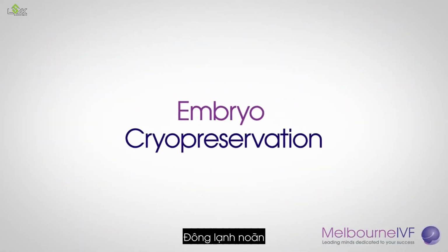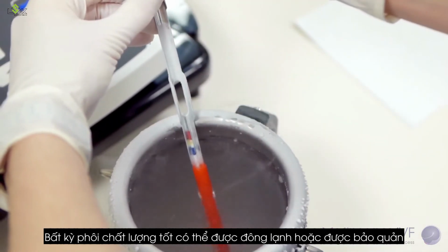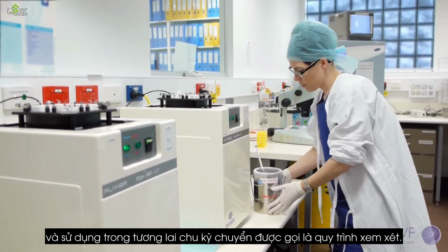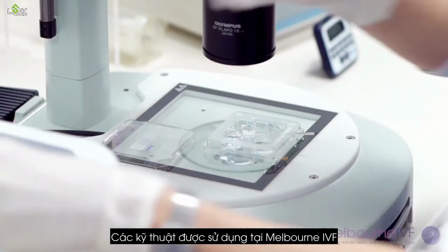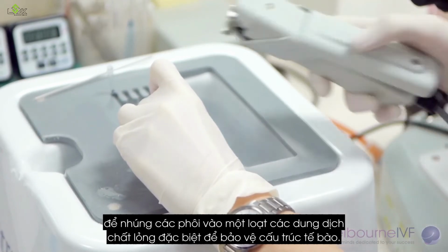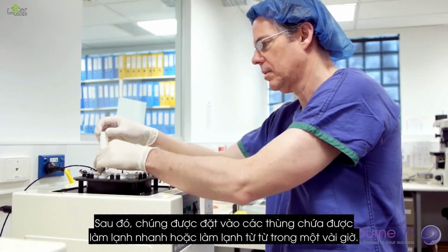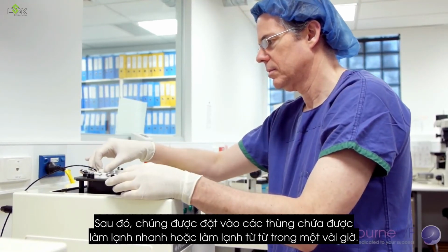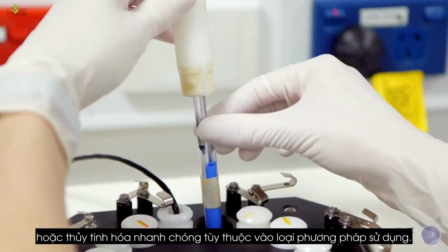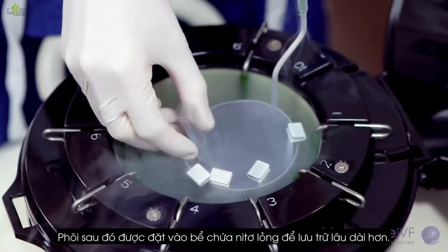Embryo cryopreservation. Any additional good quality embryos can be frozen or cryopreserved and used in future transfer cycles, known as a thaw cycle. The techniques used at Melbourne IVF are to immerse the embryos in a series of special fluid solutions to protect their cellular structure. They are then placed into storage containers which are cooled either slowly over a few hours, slow freezing, or rapidly, vitrification, depending on the treatment type. The embryos are then placed into tanks of liquid nitrogen for longer-term storage.